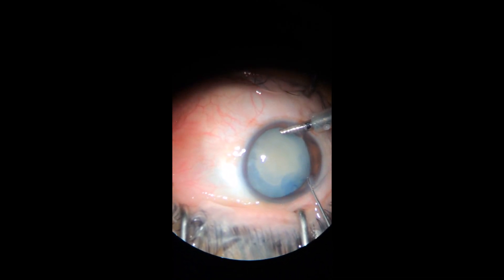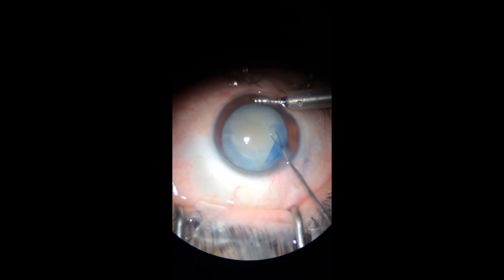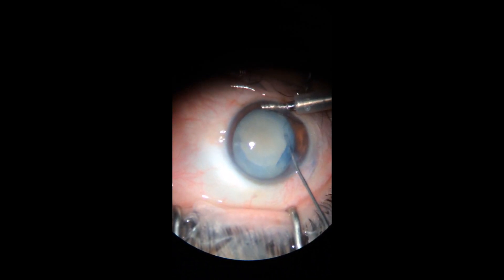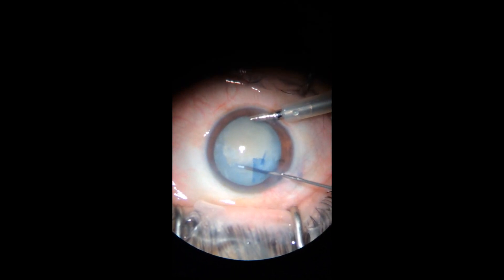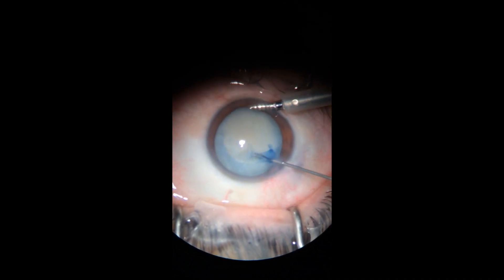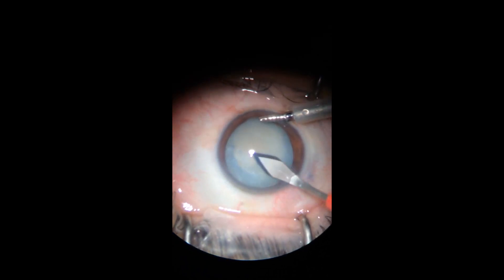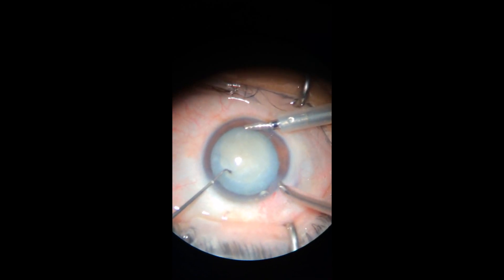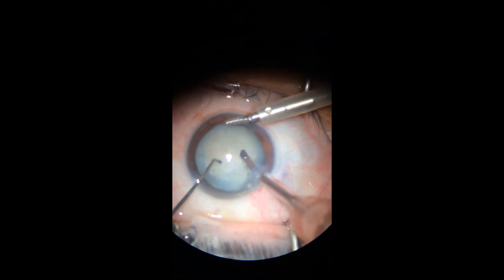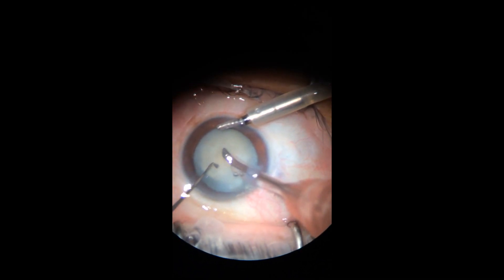She had a rubbery membrane right underneath the anterior capsule. I was trying to first do the capsulorhexis with the bent cystotome, but it was very adherent to the structure underneath. I thought that was just another type of intumescent cataract, so I proceeded with the Utrata forceps and finished the capsulorhexis.